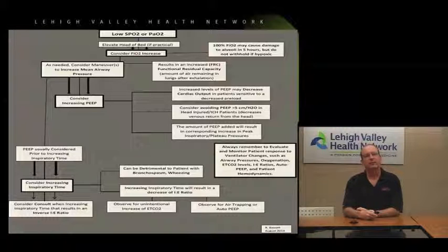I ask you to go over this little cheat sheet I made up. It's also good to go over even after a call. If you had some problems, look at it afterwards, even if you didn't look at it right at the time, or maybe on the way out to something. If you're going out for an ARDS patient or a difficult patient having problems ventilating, go through this ahead of time. Anytime we're making ventilator changes, though, you have to monitor the patient's changes, whether it be their airway pressures, their oxygenation, their end tidal, their IE ratios, auto PEEP, and even their hemodynamics, like their blood pressure and heart rate.